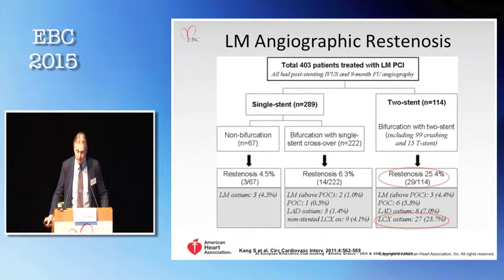As you know, we have a more than 15-year registry for left main intervention in our institution, and we always use very aggressive pretreatment and plaque modification with cutting balloon, always IVUS guided. And in this study, as in previous years, we tried to cut or modify the plaque in the ostium, and then to put only one stent.